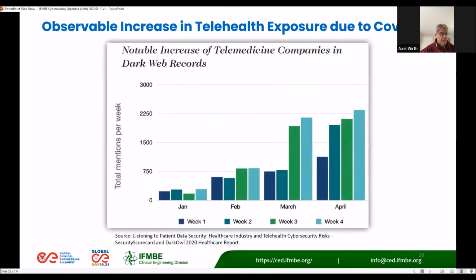But what is also interesting, and that goes back to my previous point, is that our challenges are the cyber attackers' opportunity. Right? So this is in the early days of 2020, when we all remember how in March and April, the pandemic took off and impacted our lives, including our ability to see care providers. And that also resulted, interestingly enough, in an increase of telemedicine companies being mentioned in the dark web, in the underground economy. So clearly, cyber adversaries were detecting that the shift to telemedicine was an opportunity for them and started discussing how they could compromise telehealth companies. And the frequency of mentioning of specific company names went up as we entered the early days of the pandemic.